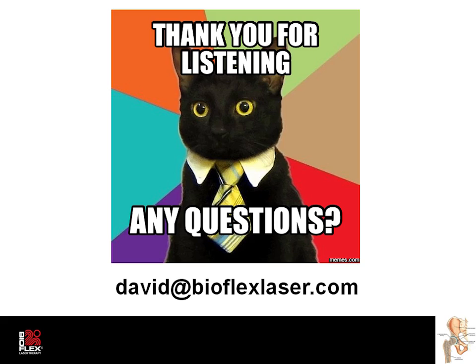Can you describe what has been called a hip pointer? Well, my understanding with a hip pointer is more of a contusion type of injury. For that, you probably still would use a hip protocol because of the depth of the muscle that's being treated, but they should respond fairly quickly. So a hip pointer, a contusion type of thing, should respond well to 6 to 12 sessions, Jeff. I know we've seen a few here in the clinic, and they've usually done pretty well.